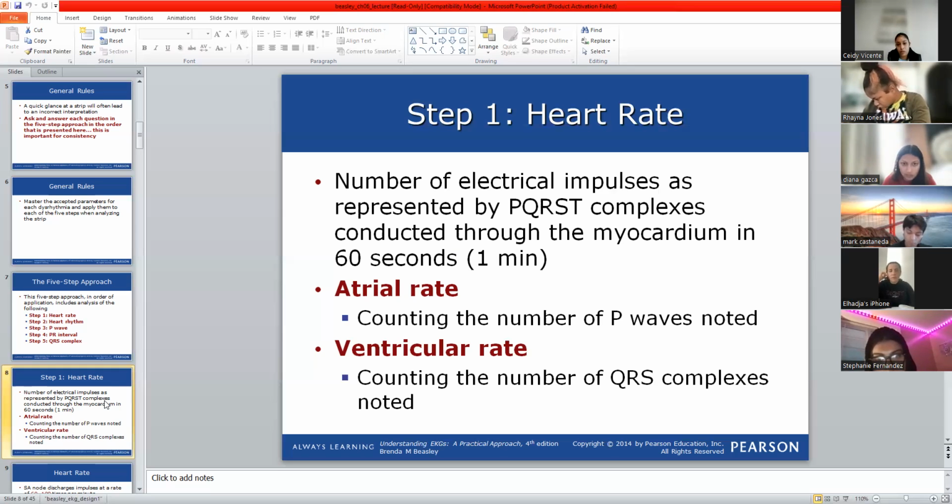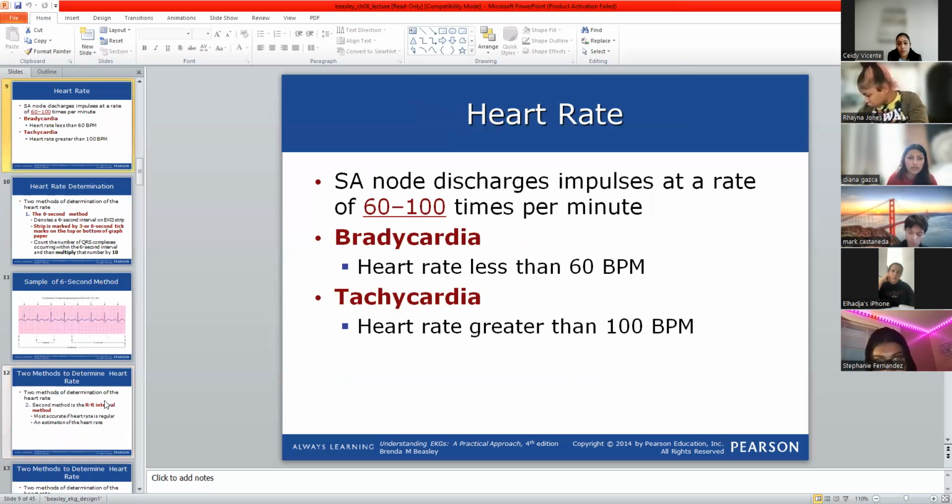Very good. So what is the atrial rate? Sometimes we get a disease with many P waves, but not the same number of QRS complexes. So this is number 1. Number 2, we are familiar with this situation. We normally know, Mark, that when you count the pulse of any patient, it is normally in the range between 60 up to 100 beats per minute.